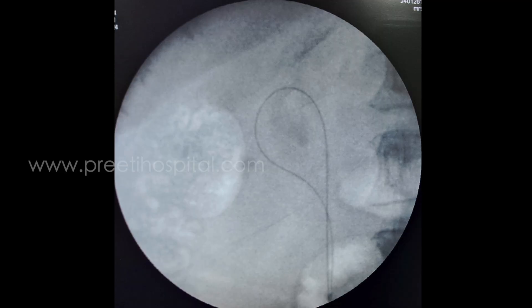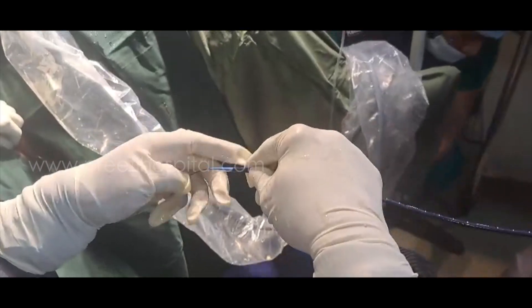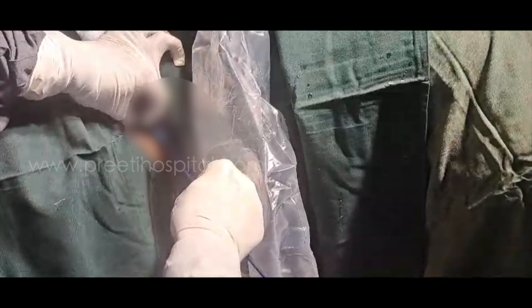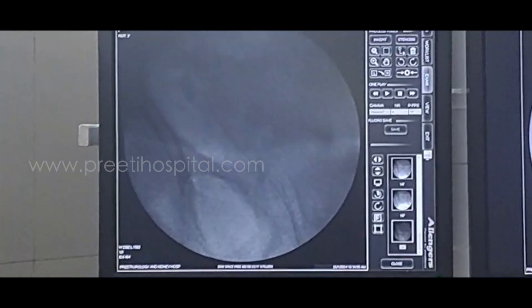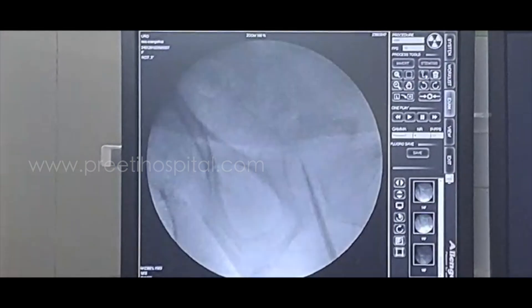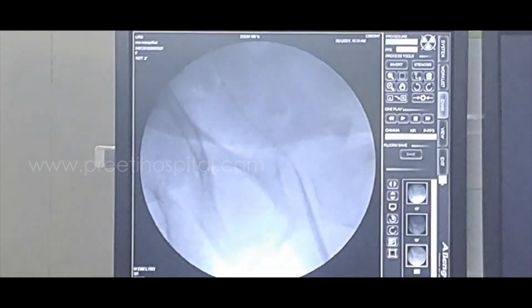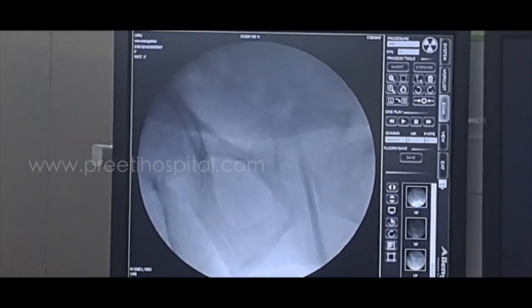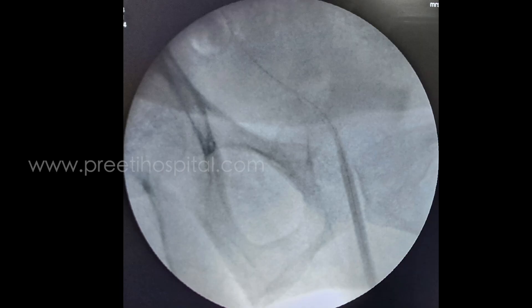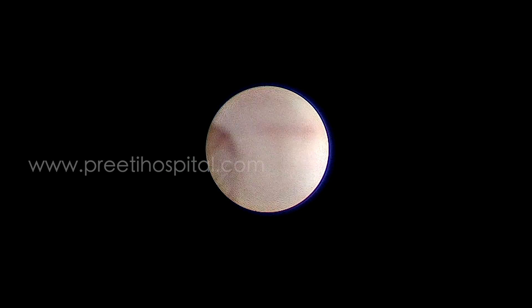I passed a guide wire, then passed directly a fan sheath. This is a female patient so I thought I would try. Then this is a normal kink that happens if the ureteric orifice is not receptive. I immediately realized this is not a case for the fan sheath.